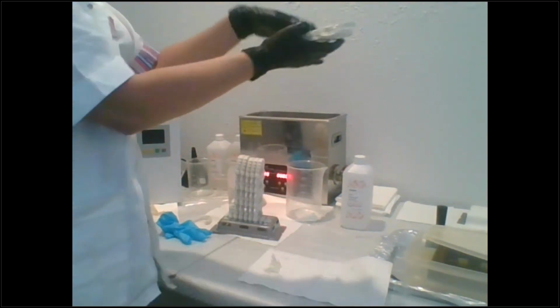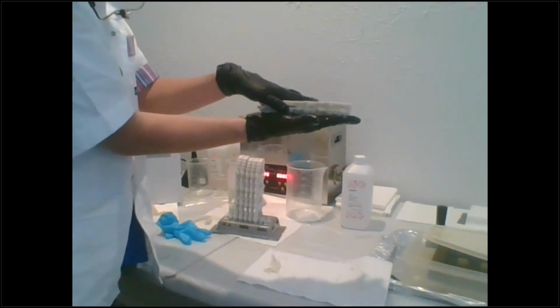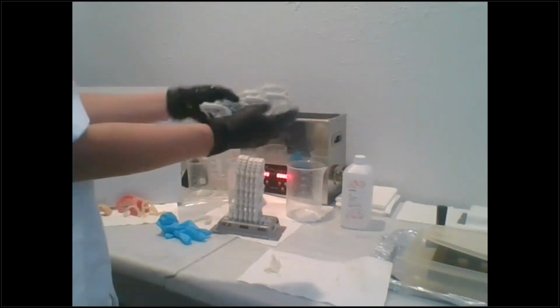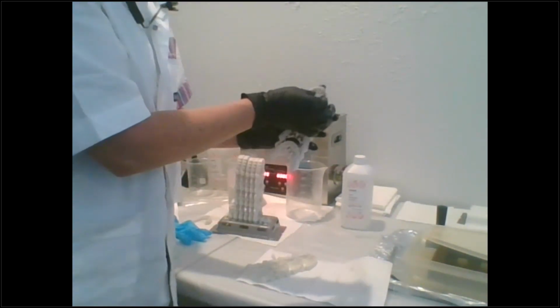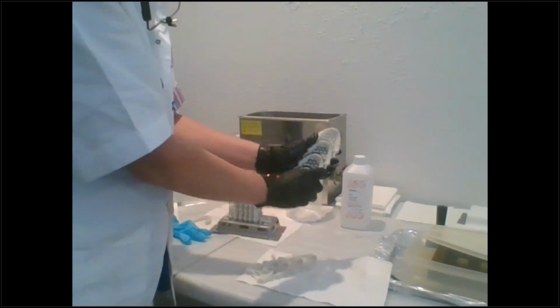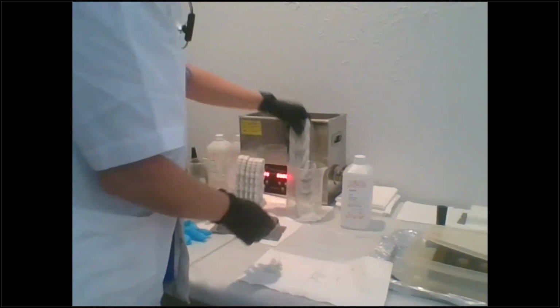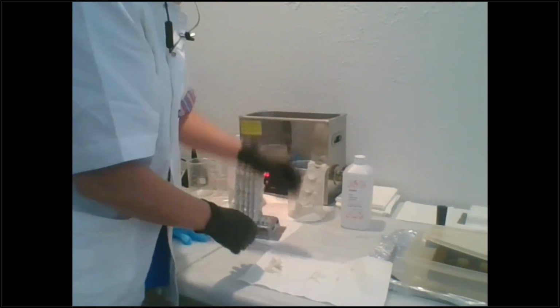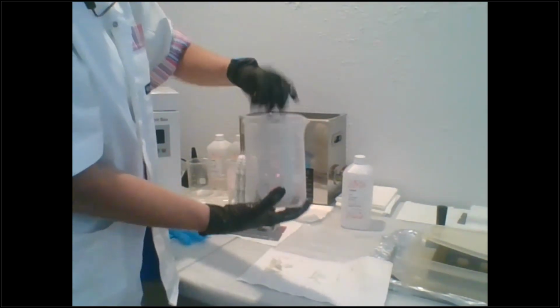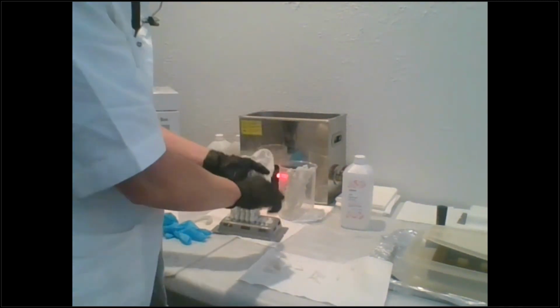Okay, so we put them all like this, maybe in our ultrasonic. And then on your clean bath, you'd flip them over and put them in the ultrasonic the opposite direction. Okay, so all of your stacks like that. Now, make sure that you get all those lingual supports off before you do your post-cure because you don't want to have any scarring at all. And if you were wanting to use beakers, you could also put them in like this as well. So you could stand them up in your beakers. So that's what we'll do with this. And so for 3 minutes and then for 2 minutes.